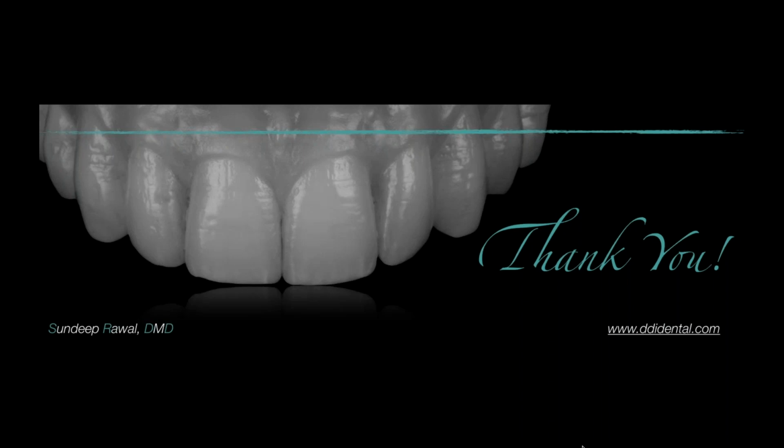Then the software allows you to merge those files. So, as I showed you in the very first opening montage, you can see where the tooth position is with respect to the edentulous arch. The key to that is you have to have well-made dentures where the teeth are in the right position. Now, that brings up a good point, which is you need to know where the teeth need to go, meaning you need to know how to make good complete dentures.